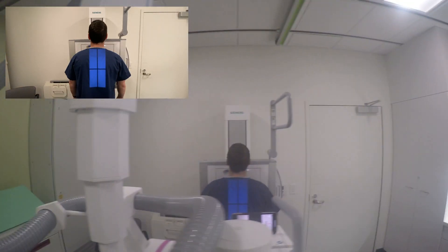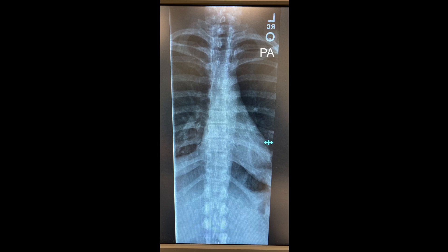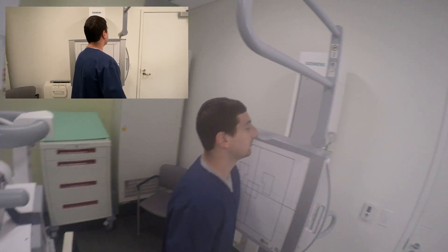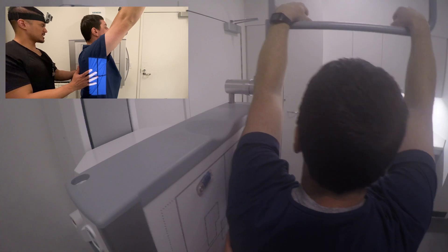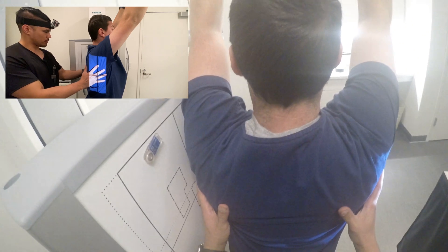Any questions? Okay, we're going to turn to your right, left side against that board. There you go. And then above your head, put both hands on this bar here. And then move your left until you touch that board, and then move forward. Move your feet with you. There you go. Go right there. Move forward just a little bit more. There you go.